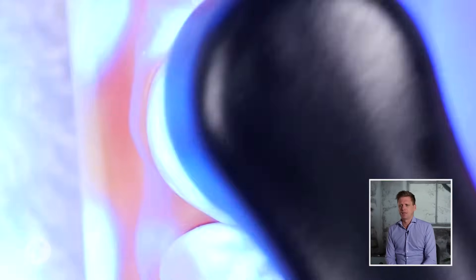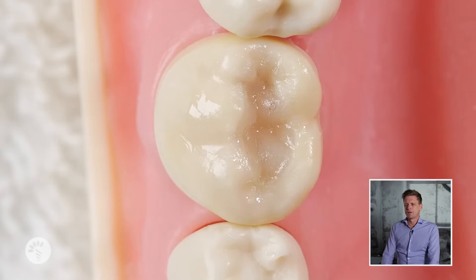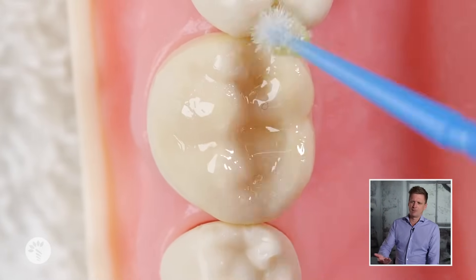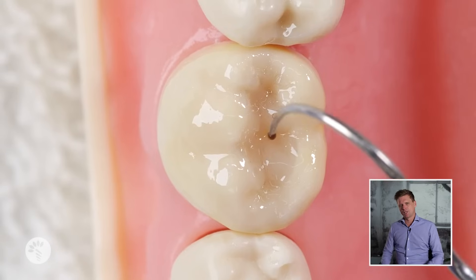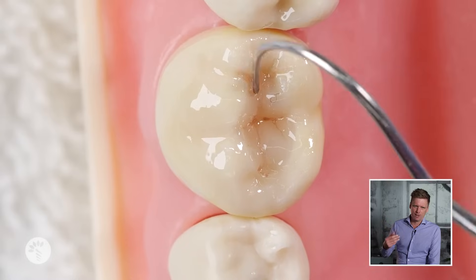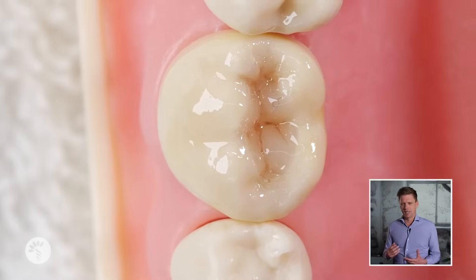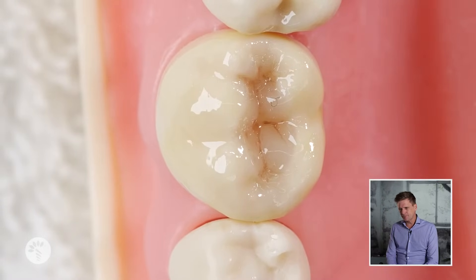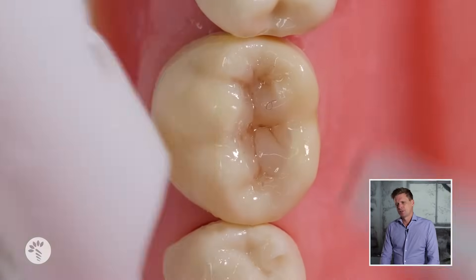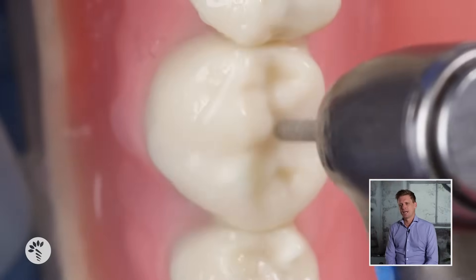If you go around doing one cusp at a time and then cure, you can do a little bit of tint if you want, and it gives you a super natural tooth shape. The trick with tint: use a little bit of Essie primer and bond on the final surface of the restoration just to give something for it to stick to, then use a very small amount of stain in the pits in the middle of the fissures and drag it around — that's how you get delicate staining. If you do too much it looks terrible. We put a little bit of glycerin over it to cure the oxygen-inhibited layer right at the end.